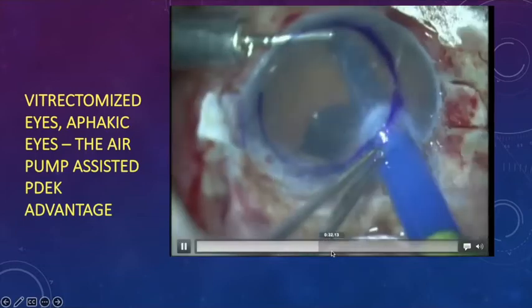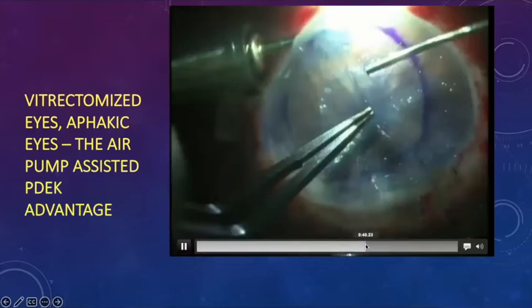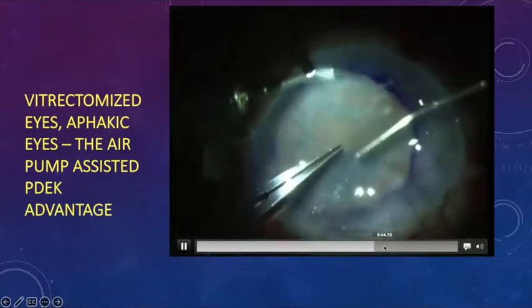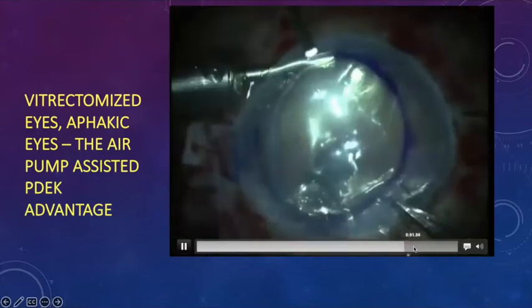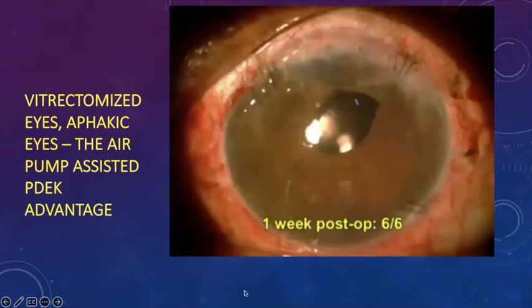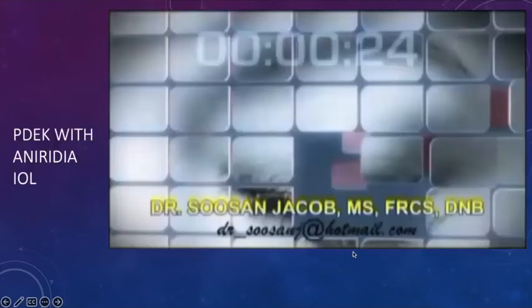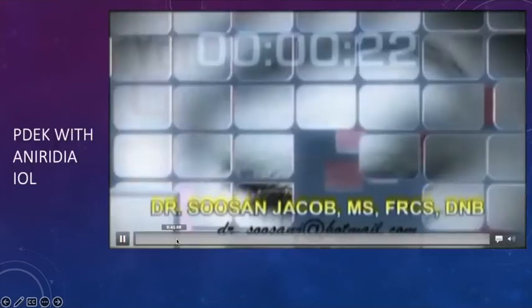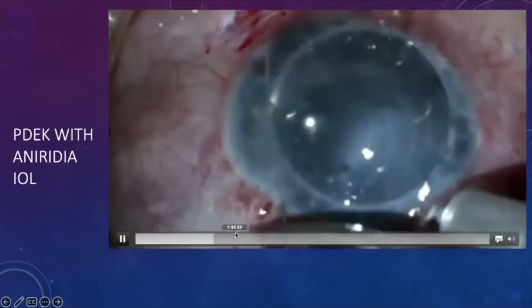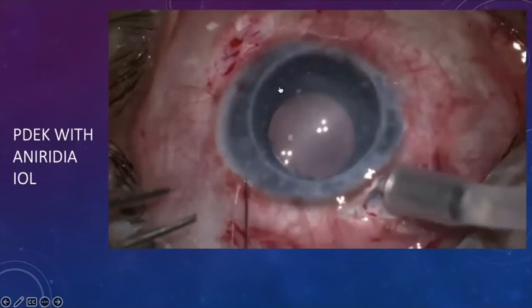So here you can see that we've already done a glued IOL. We've placed the IOL in position. We are using the PDEK technique to identify the side, and then we open up the graft. And here is the first week post-operative appearance of the patient. Dilated and fixed iris can be done. PDEK, we can do it with an iris-less IOL where there's essentially no iris at all. It's a monocameral eye.